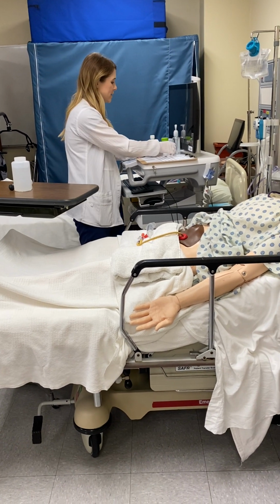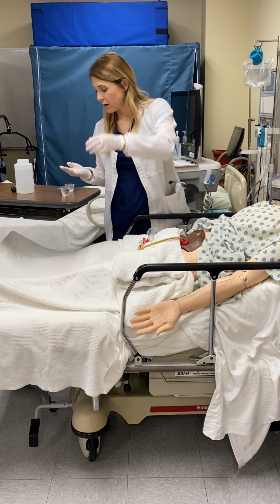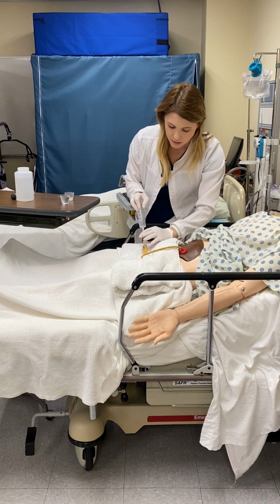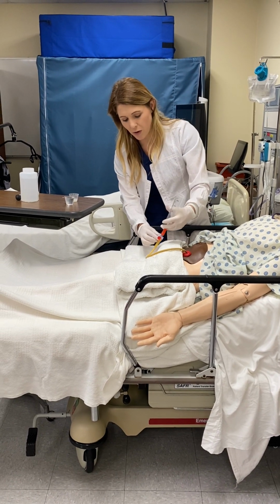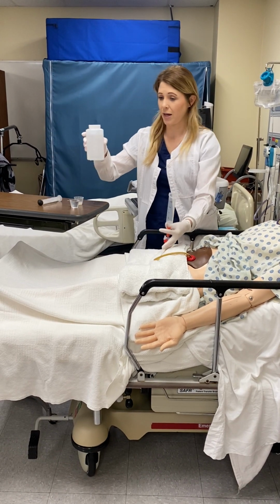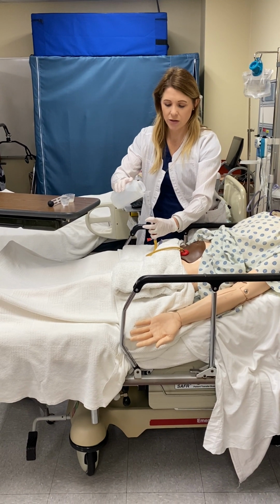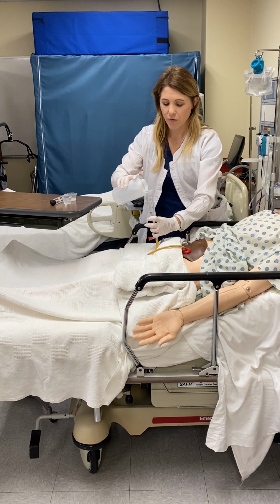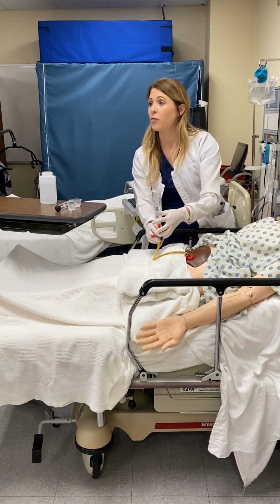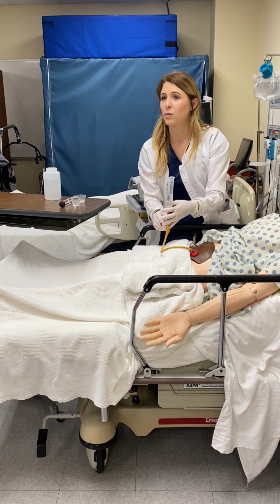Okay, and meds by gravity. So with that, I think I just stripped that out. So we're gonna start, sir, by inserting this large bore syringe, and I'm going to open it up once I get some water in here. So this takes a lot of moving. Okay, so I'm gonna start by just flushing your tube with 30 mLs. This is important because I wanna make sure the tube's flowing well before I instill meds in there. And also it has a lot of feeding still in there as well, right?